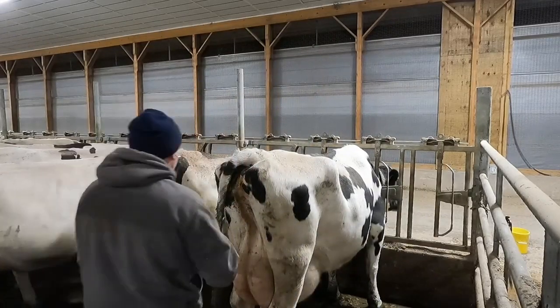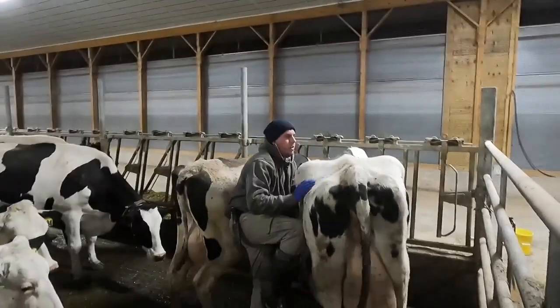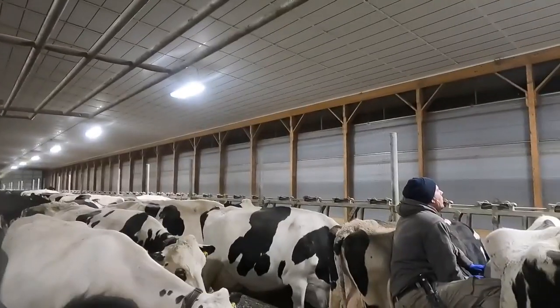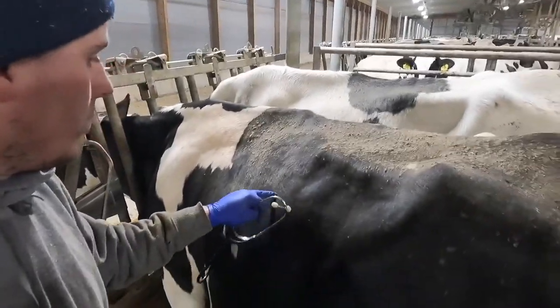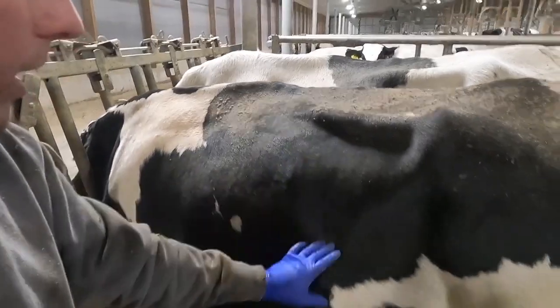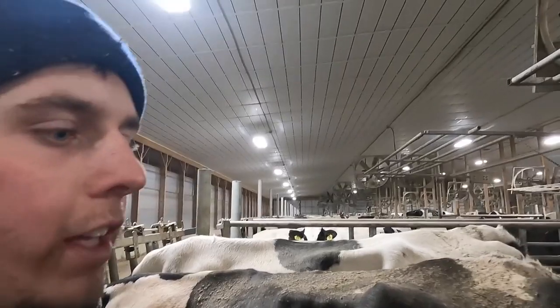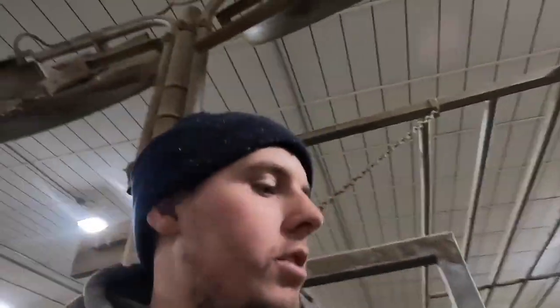I'm going to check to make sure she doesn't have a DA — a displaced abomasum — and you can hear that by pinging on the side. I run my stethoscope across here and just flick it like that, checking this area to see if I hear anything. If it has a DA, you'll hear a ping like flicking a basketball. I didn't hear anything, so she's good to go.